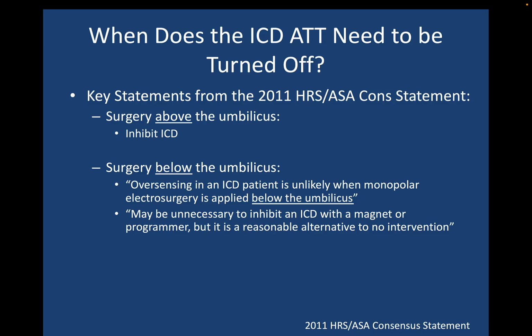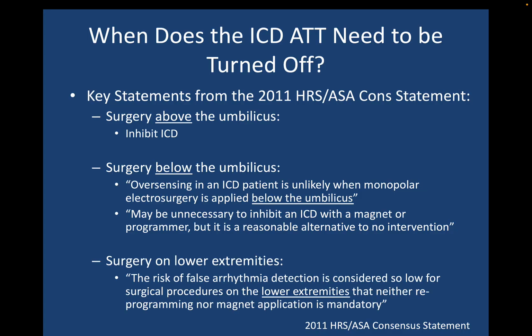In other words, it's telling us if the surgery is below the umbilicus, it doesn't say you don't have to suspend the anti-tachytherapy. It's saying it's an option. Now, with respect to surgery on the lower extremities, it says the risk of false arrhythmia detection is considered so low for surgical procedures on the lower extremities that neither reprogramming nor magnet application is mandatory.